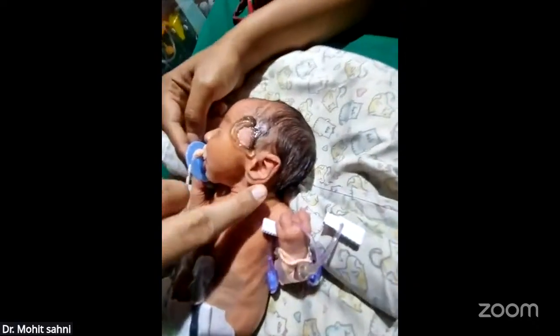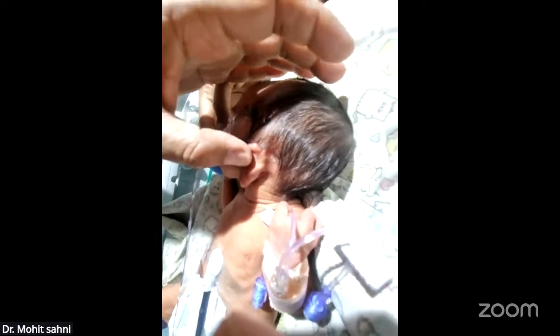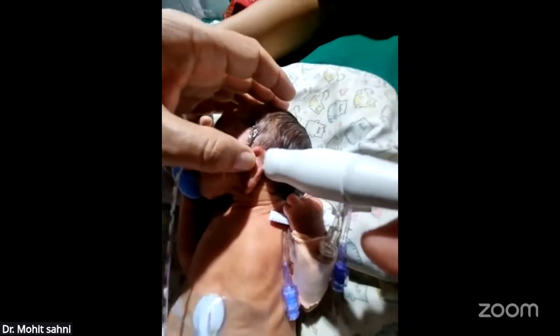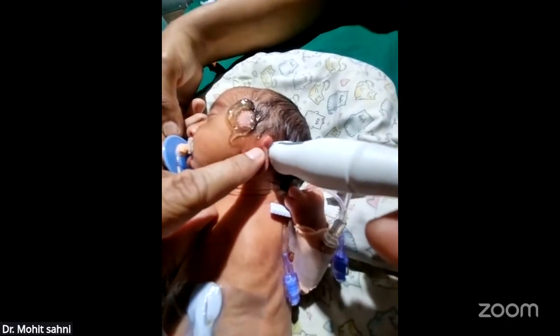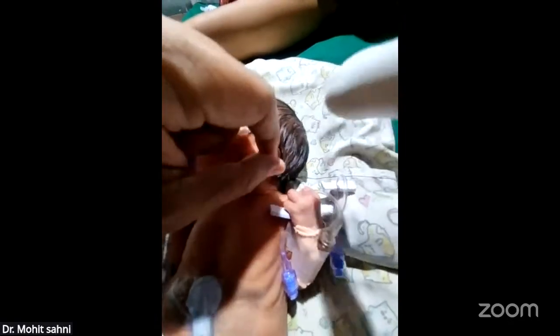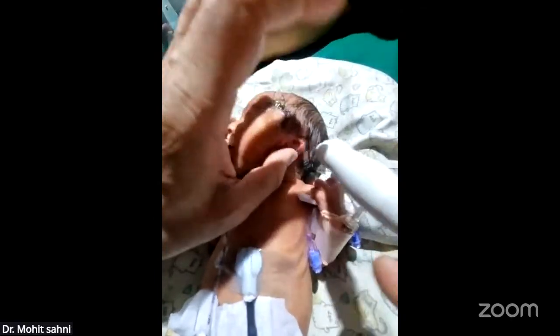So the mastoid fontanelle is just behind the ear here. When we put the probe, we put the probe in two ways. One is like this, where the pointer is pointing at 12 o'clock. And the other one is where the pointer is pointing at 9 o'clock, 3 o'clock here.